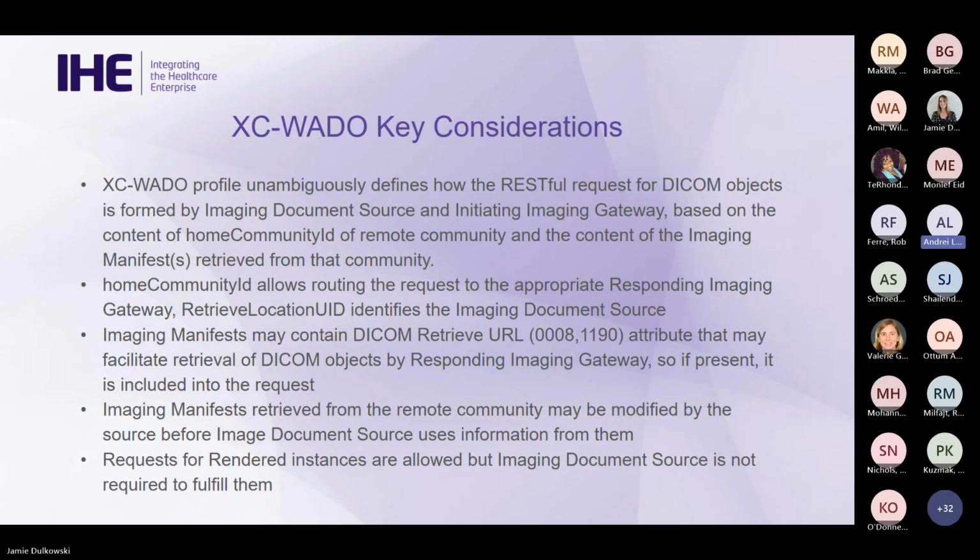However, considering the complexity of the communication and transmission of the requests across multiple boundaries, multiple network environments, through multiple firewalls and other network security configurations, it's allowed, but it's not required for the document source to fulfill those requests, and the imaging document consumer should really be prepared to handle that.